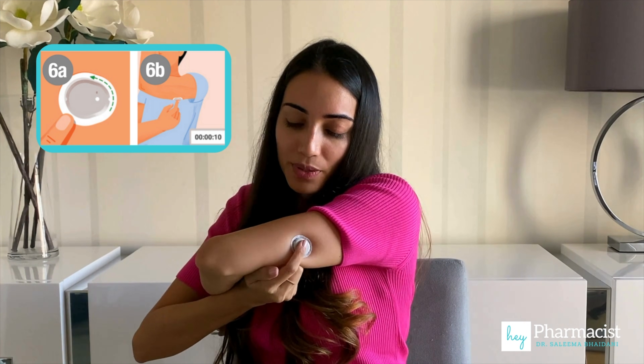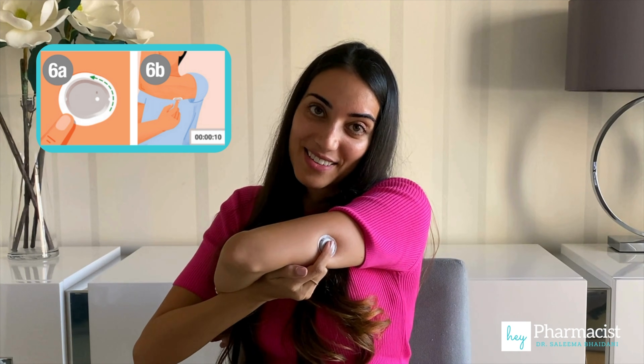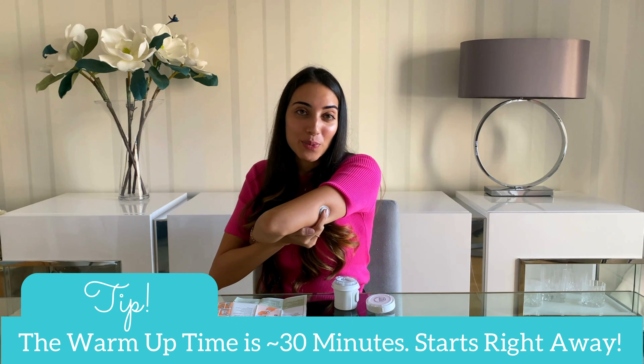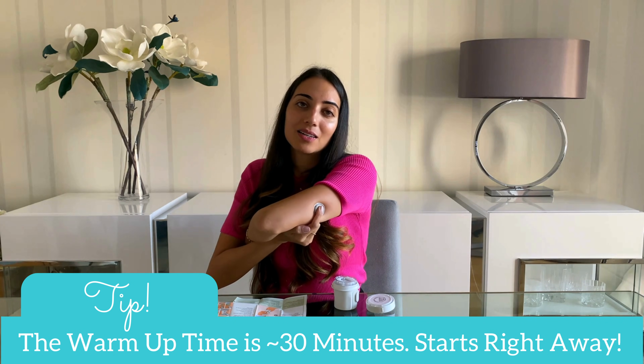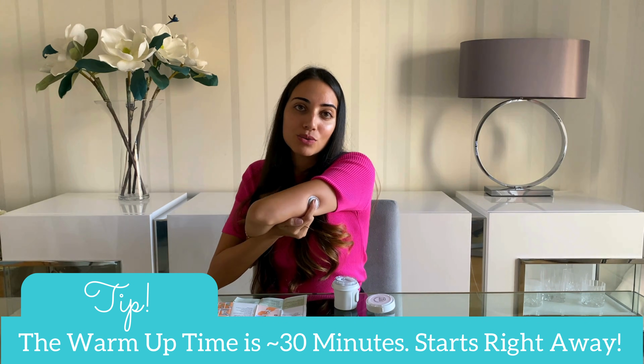Then gently press on top of the sensor for 10 seconds. Something interesting to note while we wait is that the warmup period for the Dexcom G7 is 30 minutes, and it automatically starts as soon as the sensor is placed. So by the time we get the app set up, hopefully we'll be closer to getting my first reading.